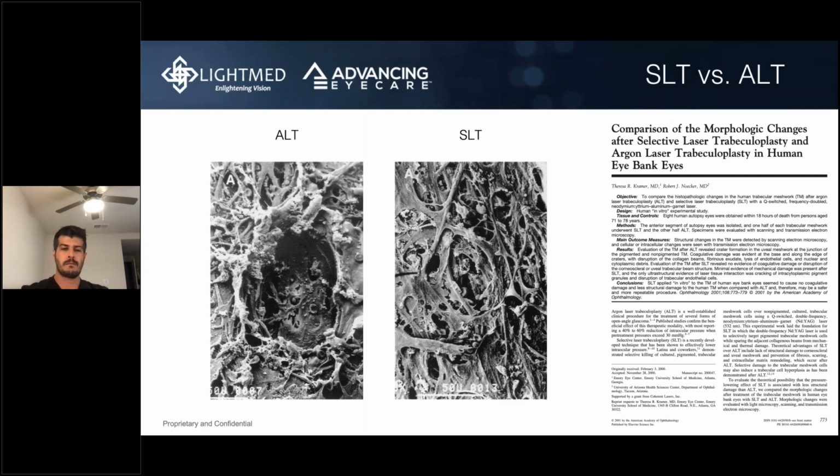Okay, perfect. And I'm going to end with one more question. It is something that you've already said, but just as a wrap up, last statement, when you are repeating the SLT treatment the second time, do you treat the same area, and how long do you wait to repeat SLT? I almost always treat the inferior angle first. And then if I need to supplement it with a second episode of SLT, I'm going to go after the superior part. Despite evidence showing I could have gone for the inferior part and probably get the same response, to me, it just makes more sense to go after the untouched area of the angle. So I go after the superior for that second episode.